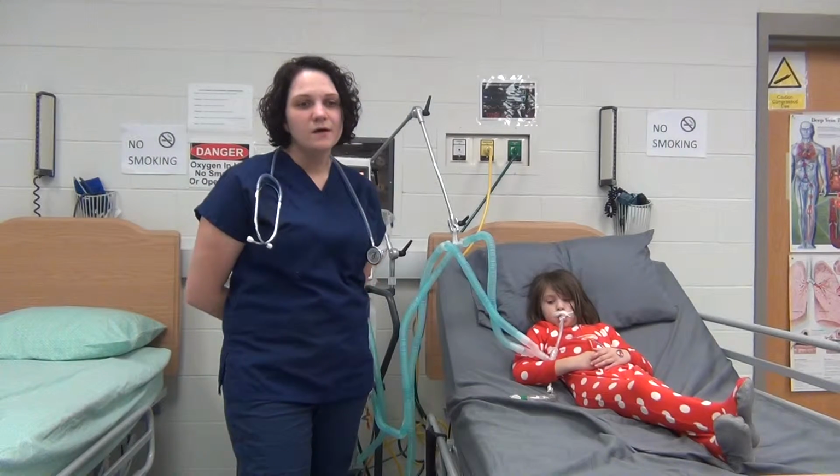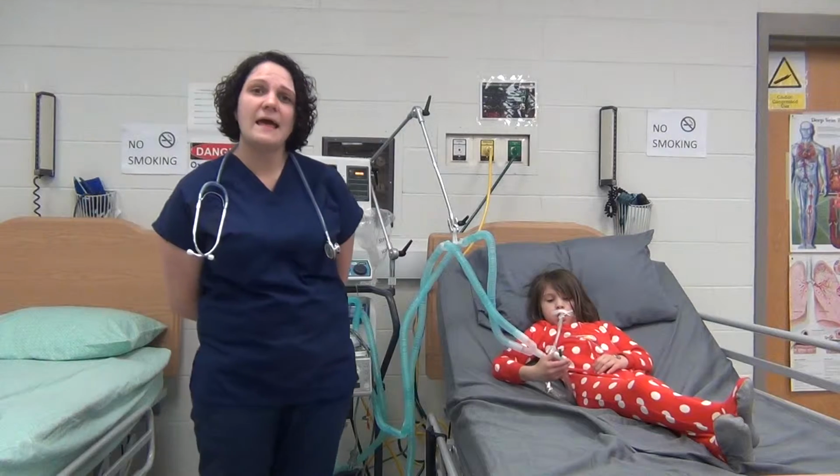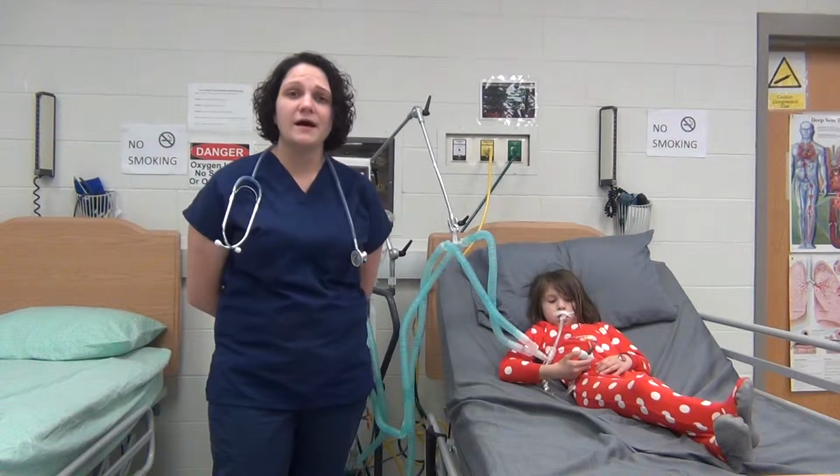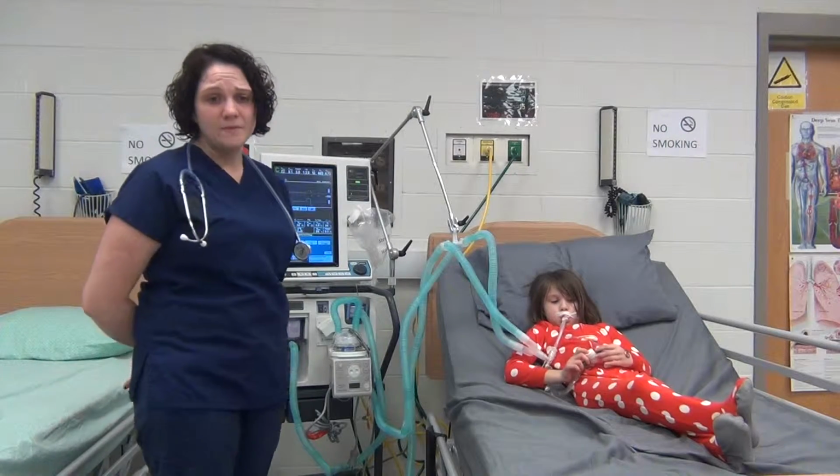I also want to make sure that her spontaneous tidal volumes are about 6 to 8 milliliters per kilogram ideal body weight. So I hope to see them about 300 to 400 milliliters.